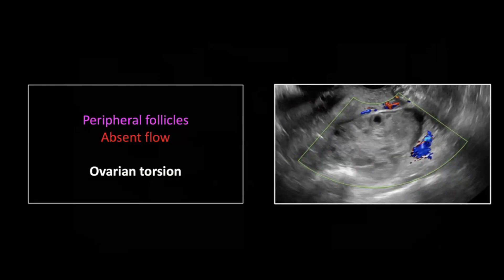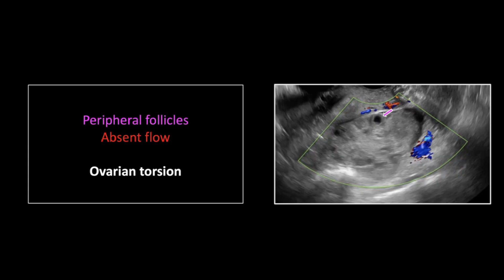This is a torsion — there's no flow in the ovary, and that's the main thing to go by. An additional finding is peripheralization of follicles: when an ovary torses, it gets edematous in its stromal center first, and that edema pushes the follicles out to a more peripheral location in the cortex of the ovary. You can see the edematous stroma and absent flow here.